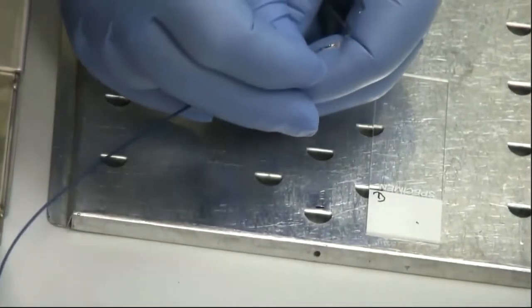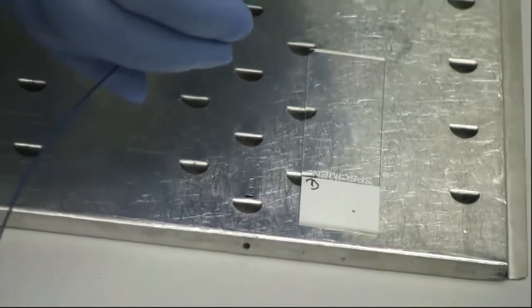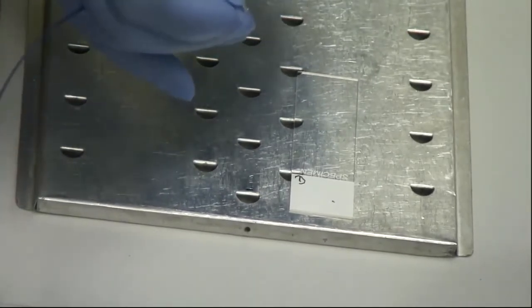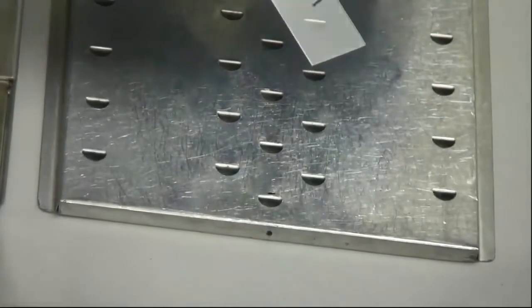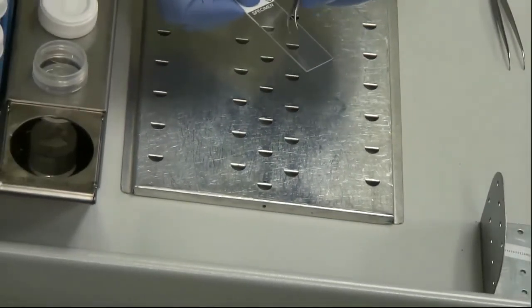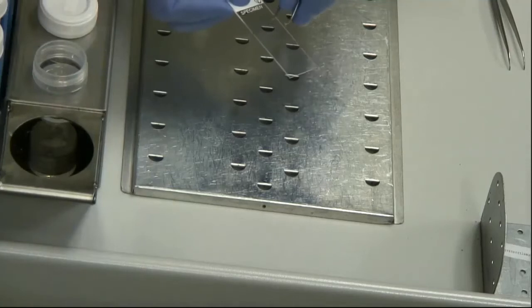Excellent, you can see this pinkish tissue right on the end of the tip. So first we're going to perform a rapid on-site evaluation. The piece of tissue is gently picked off the biopsy forceps with those little tongs, and it's gently placed on the slide, and then the specimen is gently rolled on the slide so that the surface cells adhere very gently to this slide, and then it's processed the same way as one would for an EUS-guided fine needle biopsy.